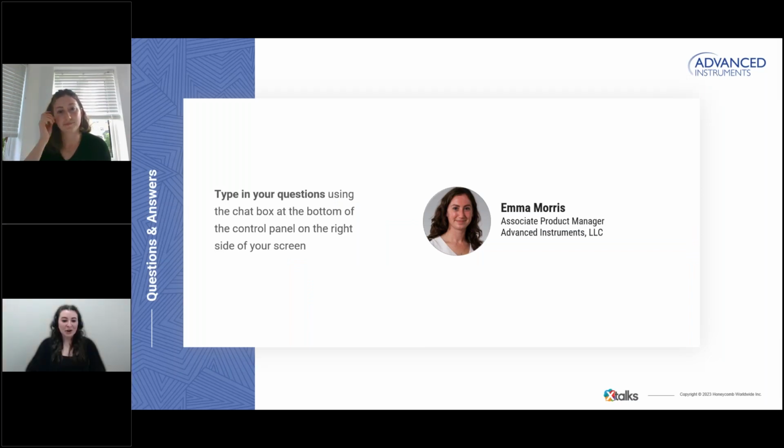So Emma, we've already received some audience questions, so I will start with those. Our first question is, is the InstaThaw reagent data also using DMSO, or is the reagent not compatible with other cryoprotectants? Thanks. So all of the banking data presented today, DMSO was present for. InstaThaw isn't considered a cryoprotectant itself. It's an additional supplement which you use with your cryoprotectant of choice, so most commonly DMSO.